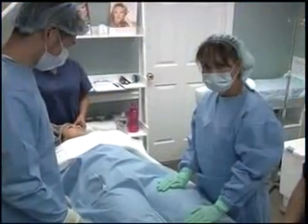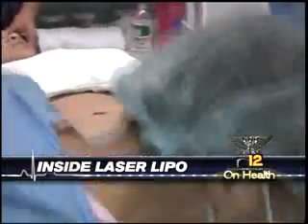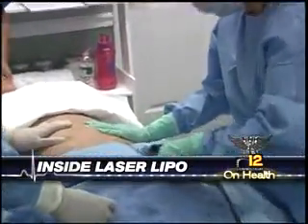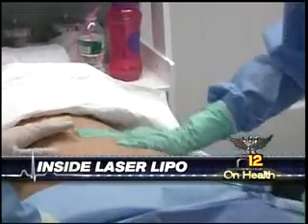We are about to show you exactly what laser liposuction looks like. We have exclusive video of the procedure and some interesting before and after photos of patients that we'll show you in just a moment. Laser lipo is touted as the less invasive version of liposuction, and it is done under local anesthesia, and doctors say it only requires a couple of days of recovery time.